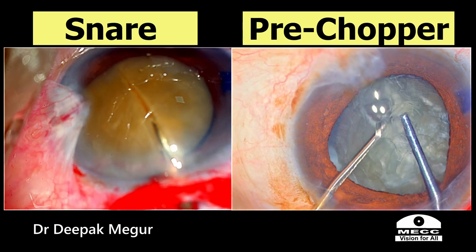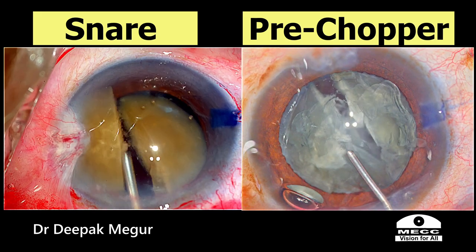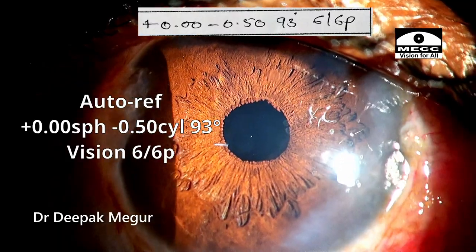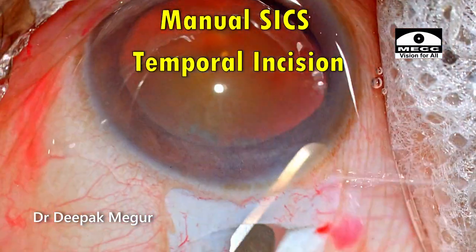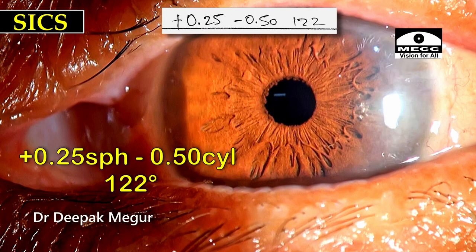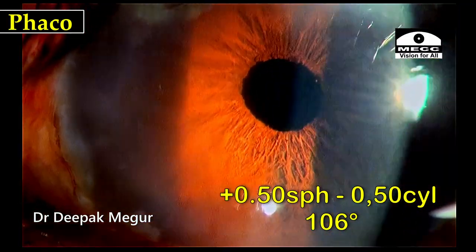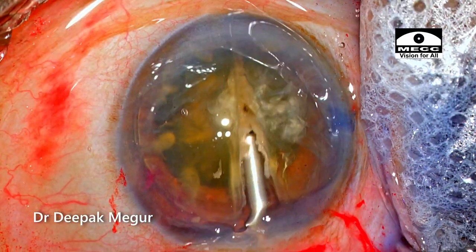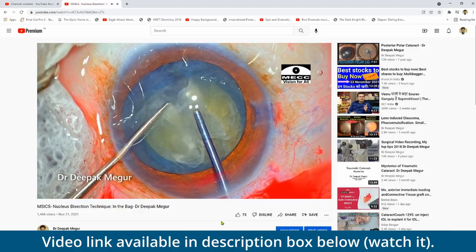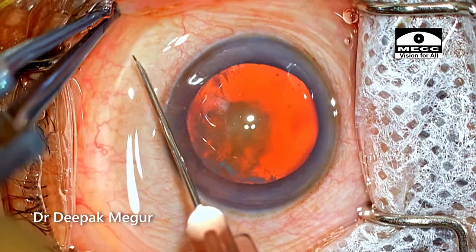As I have been repeatedly commenting, learning to bisect the nucleus is a great way to improve the post-operative refractive outcomes in manual small incision cataract surgery. Once we start doing temporal incisions and learn how to bisect the nucleus, our post-operative refractive results are going to be almost comparable with that of phacoemulsification. I have previously demonstrated the in-the-bag bisection technique as well. This case shows the use of a snare for bisecting the nucleus.